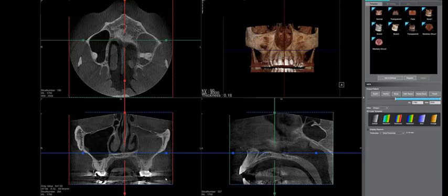Got it. Okay. One feedback we sometimes hear is, well, geez, downloading the entire data set, it's very large. How do I email it? Sometimes that's a little clumsy just because it's a very large data set. And there's that little capability on the output where you can actually create a little video of walking through the slices.